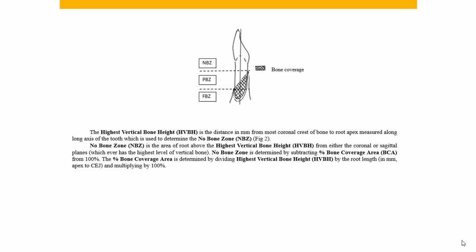The tooth is broken up into three zones. You have the no bone zone, which is the area of the tooth that has no bone coverage around the root — it's from the CEJ to the highest crestal bone, measured from the sagittal or coronal view. Then we have the partial bone zone. Normally, teeth — especially lower incisors — have a slightly higher level of bone on the lingual than on the facial, and that is taken into consideration. Below the partial bone zone we have the full bone zone, the area of the root considered to be completely covered with bone.